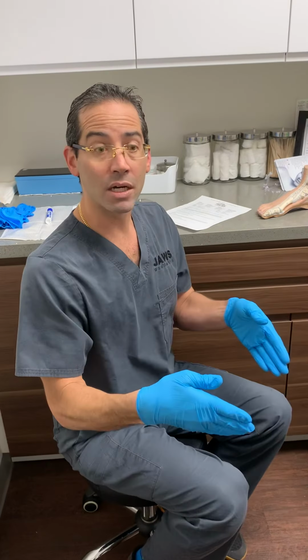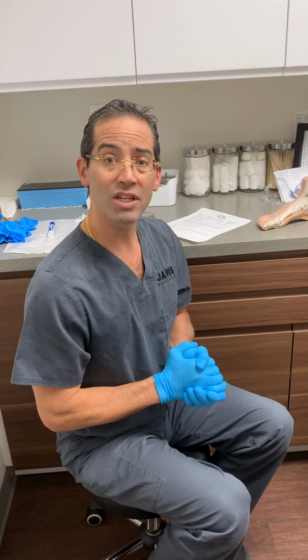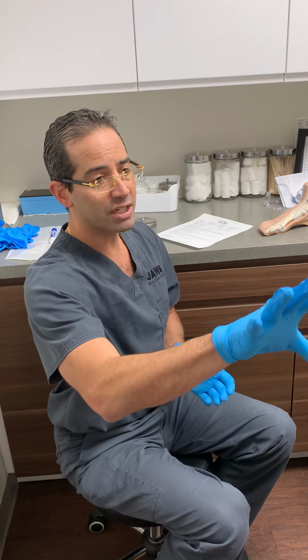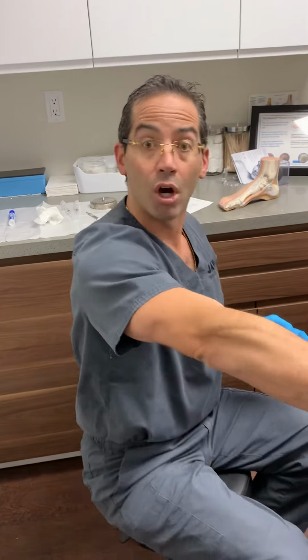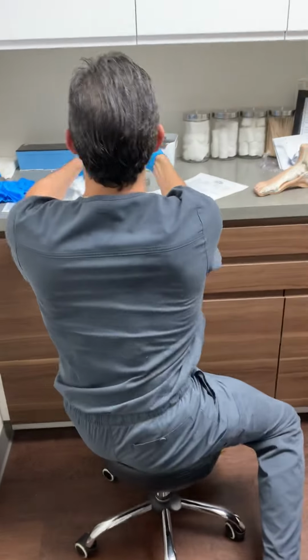We're going to perform what we call the arthrocentesis, the ankle joint injection, as well as the subtalar joint injections, with the hopes that this will improve the patient's discomfort. We've already demarcated the area. Let me bring this down because the patient's name is there. Our ultrasound right here, always our best friend. We've already demarcated the area, so without further ado, let's do this.